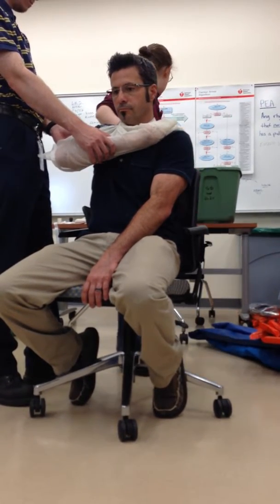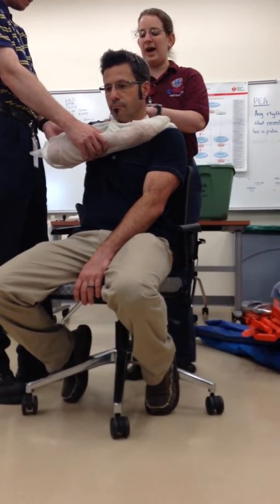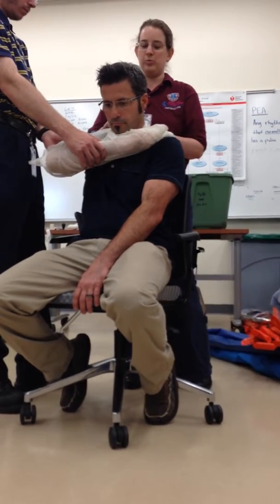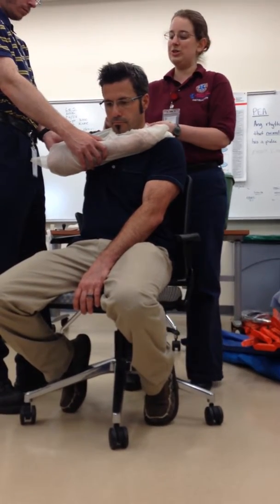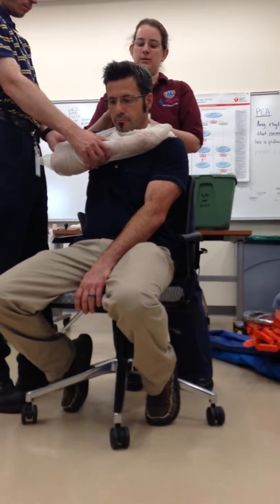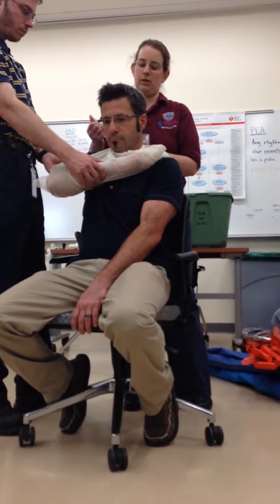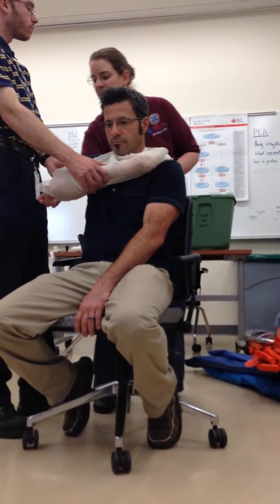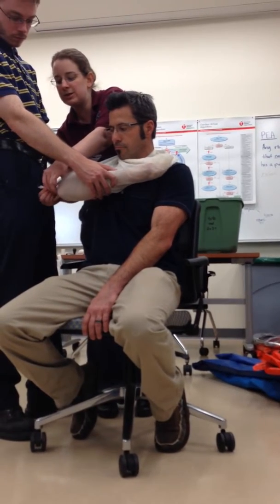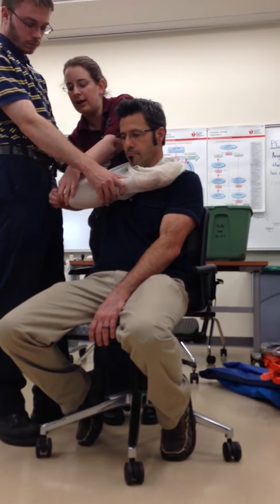And I need to grab some padding. You always pad knots that you tie so that the knot itself doesn't become a pressure point on the patient. So I'm just going to tie. You can tie your surgeon's knot, okay? And then you can tie your safety. And then I'm going to come back over here, and I'm going to tie a little tip in this. You just kind of twist it off. You tie it in a little knot.